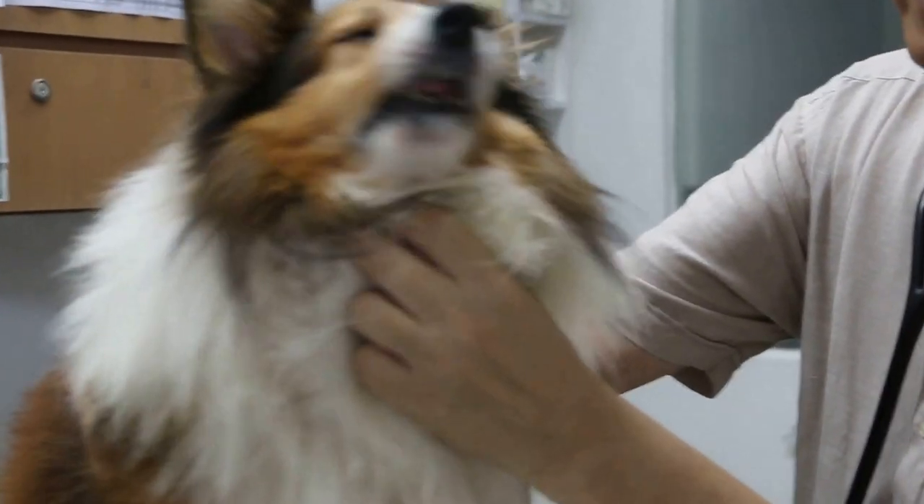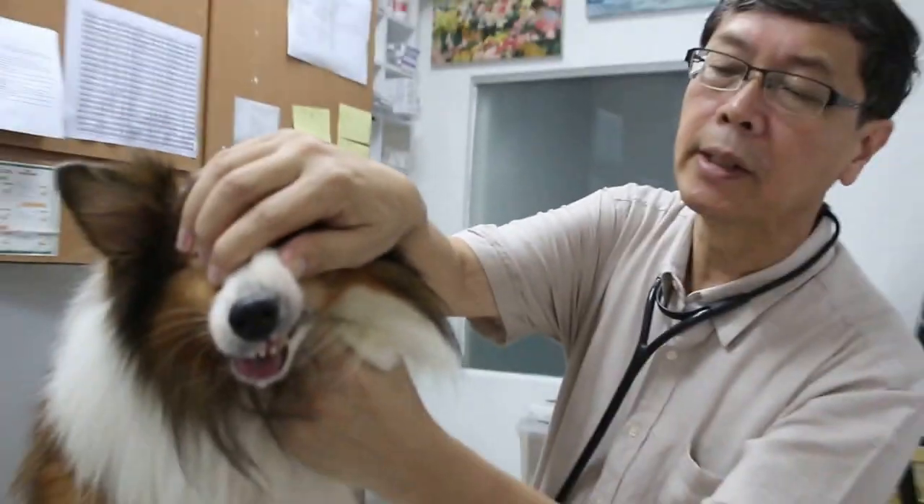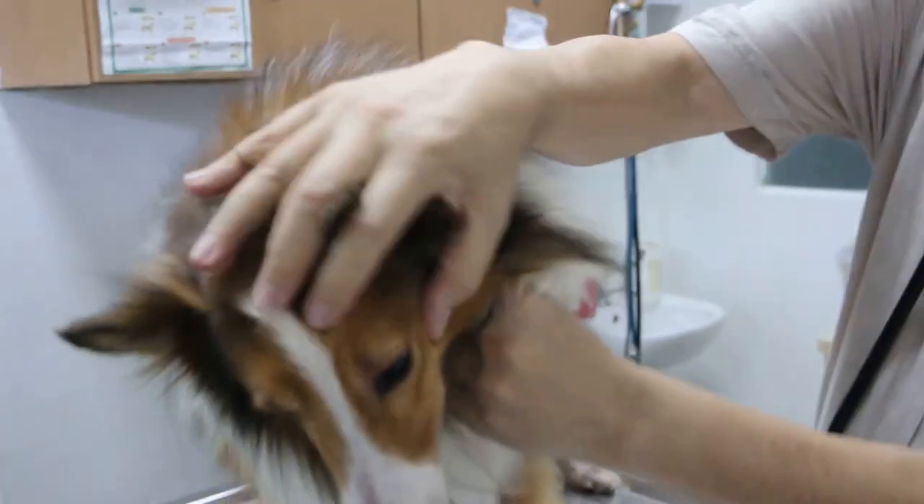Now, this dog has bad breath and periodontal disease stage 4, where the gums are receded, as you can see there. Normally, there shouldn't be exposure of the roots, but the roots are exposed and the tartar is very thick, as you can see.